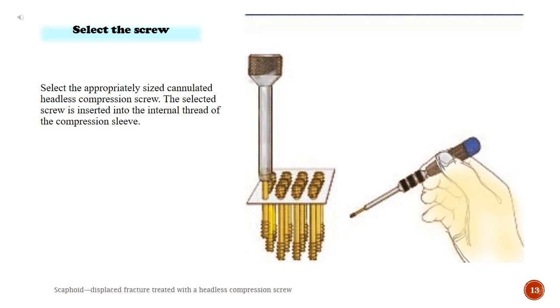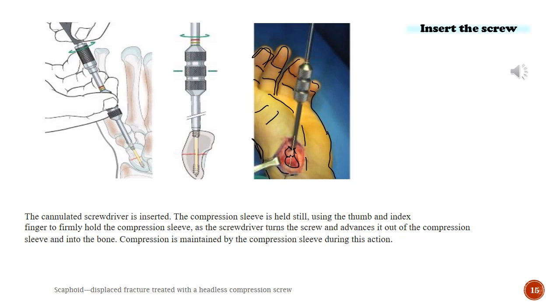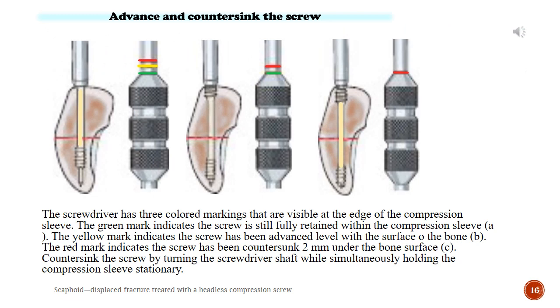Select screw. Select the appropriately sized cannulated headless compression screw. The selected screw is inserted into the internal thread of the compression sleeve. The screw and compression sleeve are inserted over the guide wire. The screw is tightened until sufficient compression is achieved. The cannulated screwdriver is inserted. The compression sleeve is held still using the thumb and index finger as the screwdriver turns the screw and advances it out of the compression sleeve and into the bone. Compression is maintained by the compression sleeve during this action.